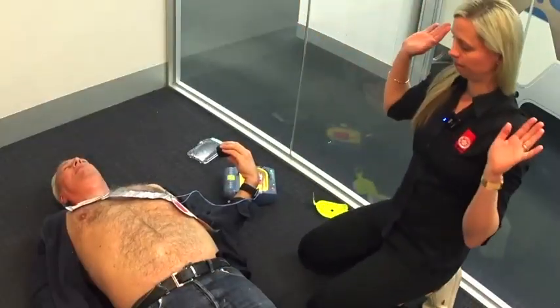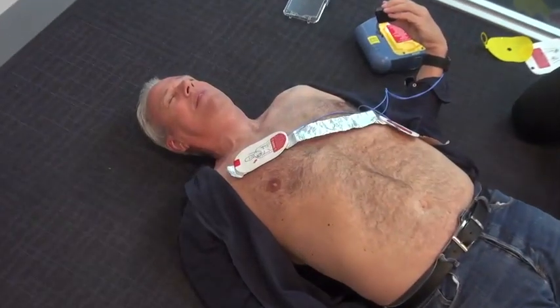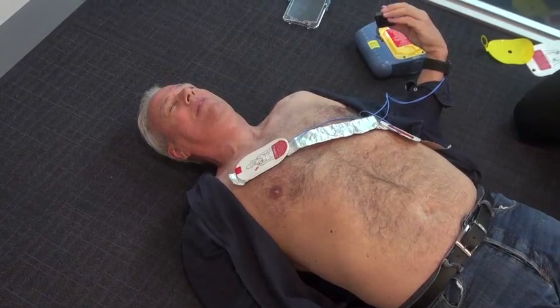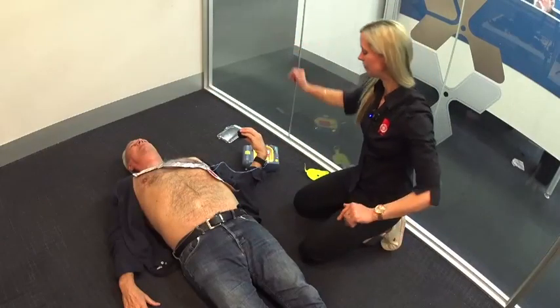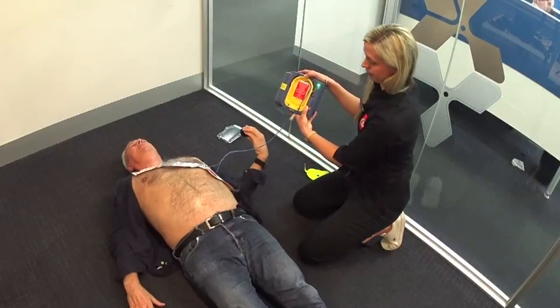Standing clear — no one should touch the patient, analyzing. Shock advised. Stay clear of patient, making sure everyone's clear. Orange button now — deliver shock now. Shock delivered.